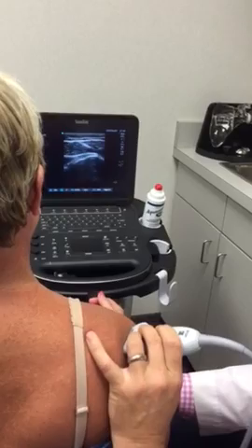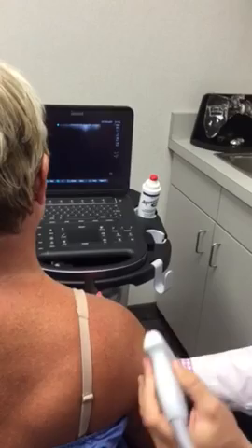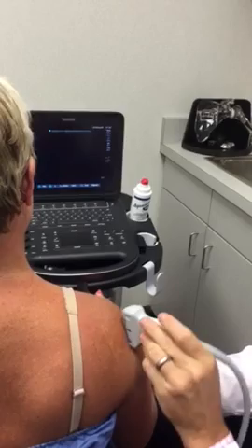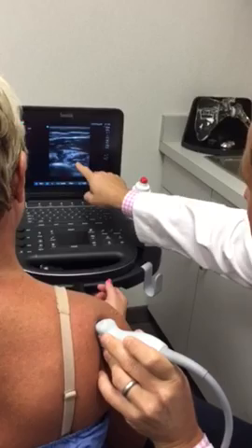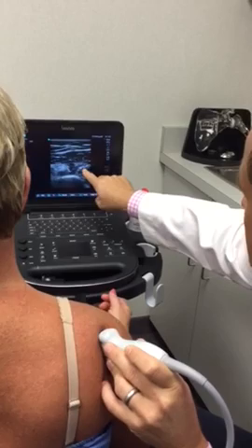Going just a little bit more inferior, that's the teres minor. If someone has a massive tear, I like to look at these in the short axis — turn the probe 90 degrees and come proximal. This right here is the scapular spine, this is the infraspinatus muscle belly, and that right there is the teres minor muscle belly. These muscles look very similar to the overlying trapezius, and we can see the posterior humeral circumflex artery.